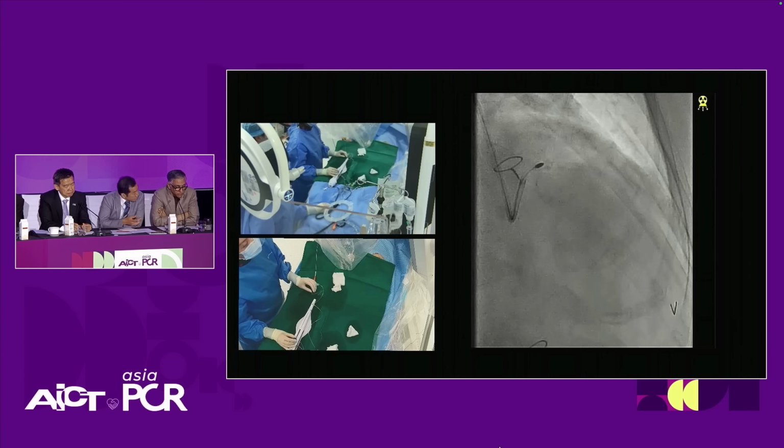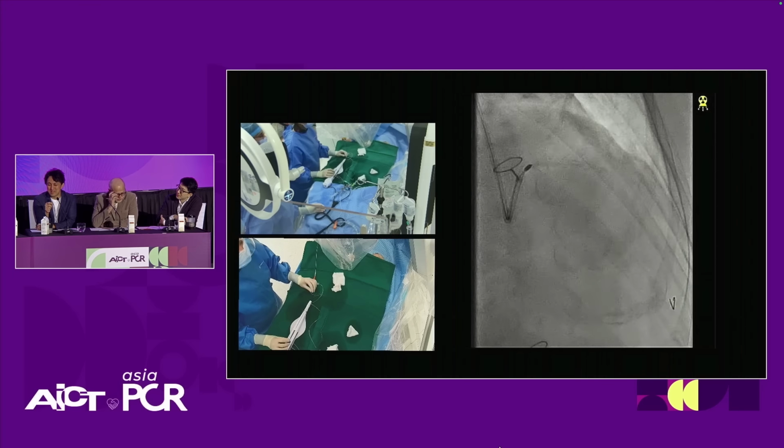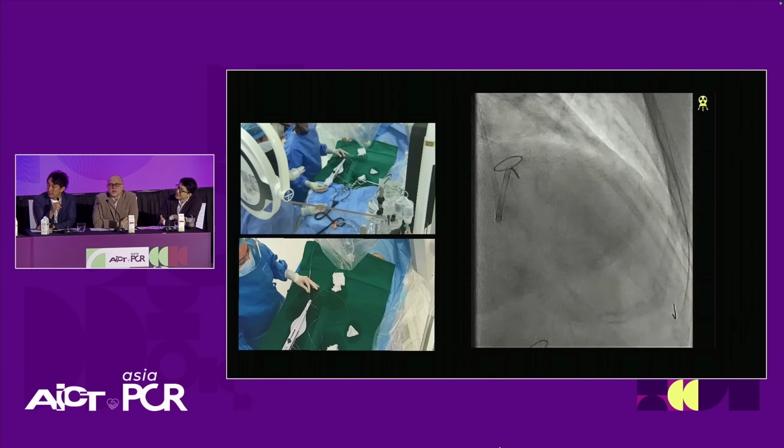Dr. Tori, Japan does quite a fair amount of rotablation, sometimes quite aggressive. 175 looks big to me, but is this big enough for Japanese style? Thank you for your question. Of course it depends on the vessel size. After you use this 1.75 rotor burr, check the IVUS. If the modification is not enough, don't hesitate to size up to the 2.0 burr.